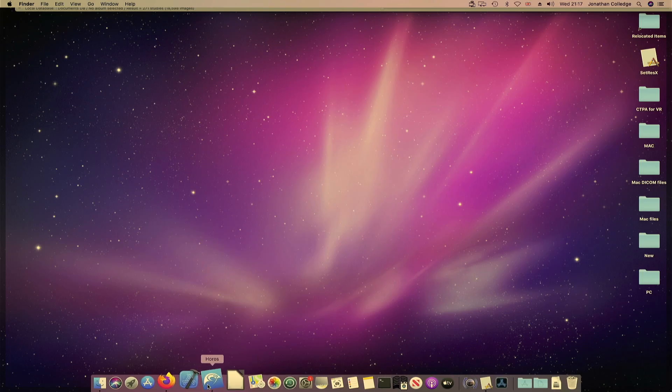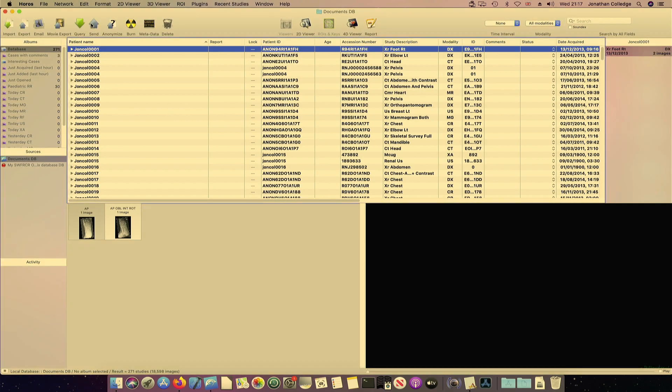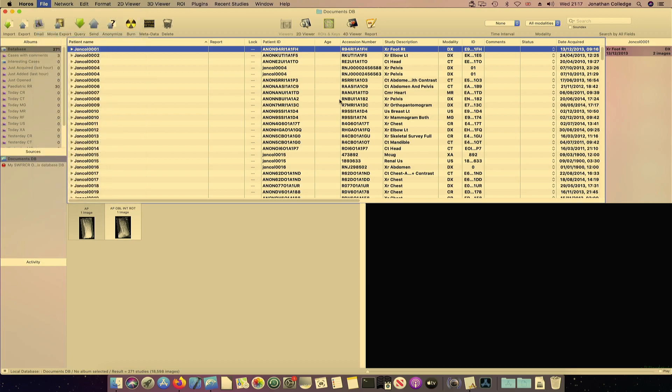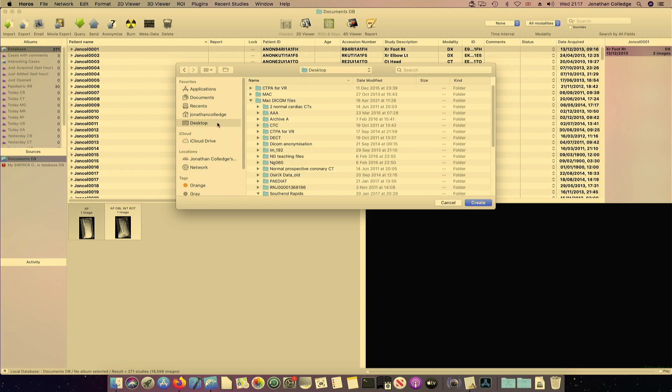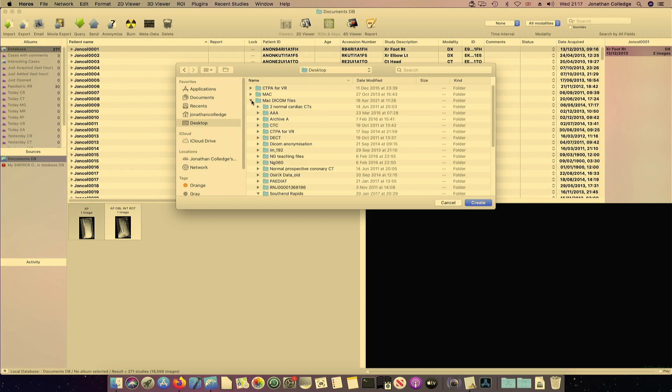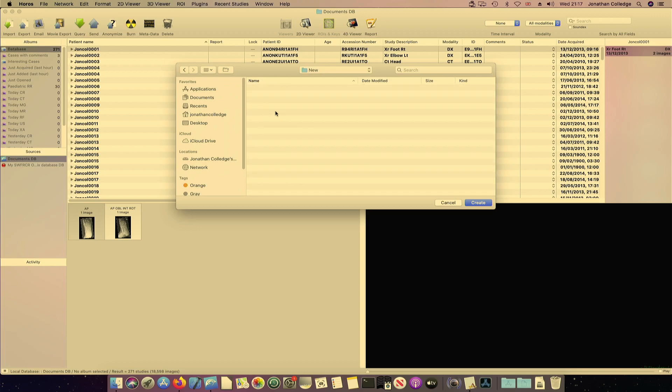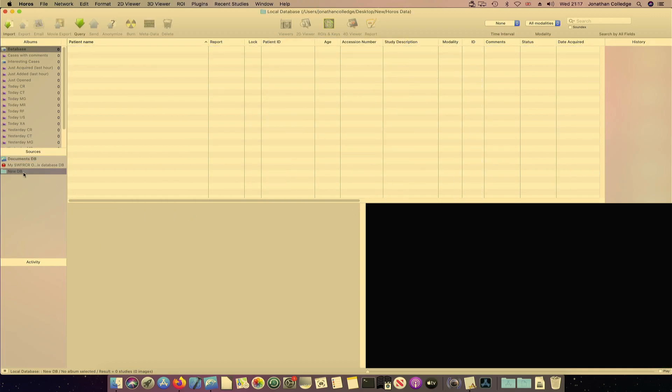And you'll see how I do that in a second. So here we are with Horus. We've got my normal default database here. And if I go to File, New Database Folder, and I just navigate to the desktop and I choose the folder that we created, which was New. So let's just click Create. And it will create a database folder down here.